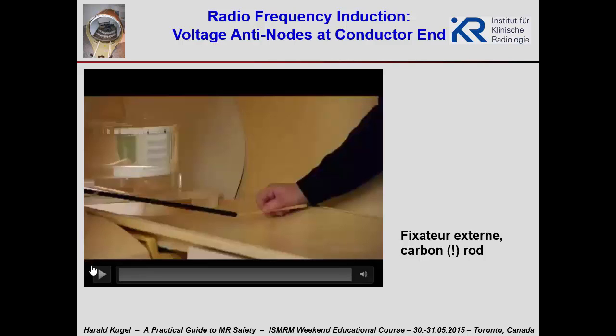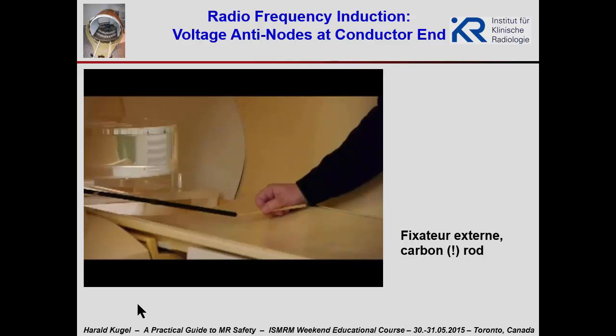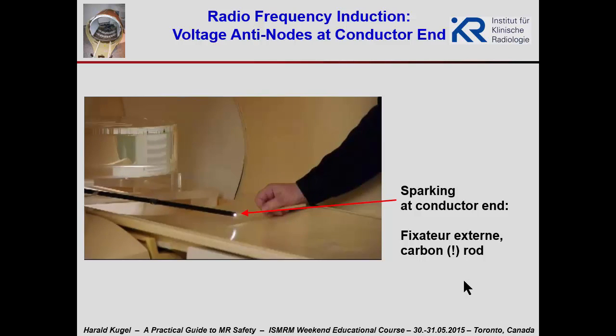So induction is maybe a problem, as shown here. Look here. This is a carbon rod, a so-called non-magnetic rod for fixateur externe. I made this slide for the case that the film didn't work, but here you see we have sparking on the conductor end. This is a fixateur externe. This is non-metallic. This is carbon. But still, we have induction there.